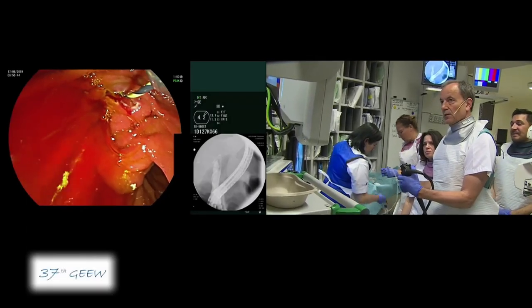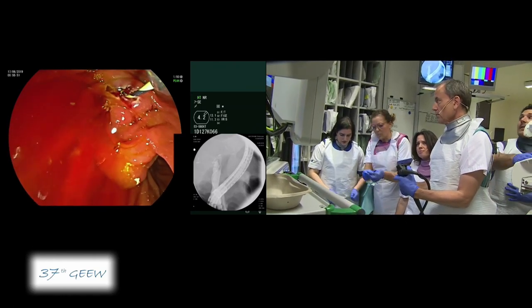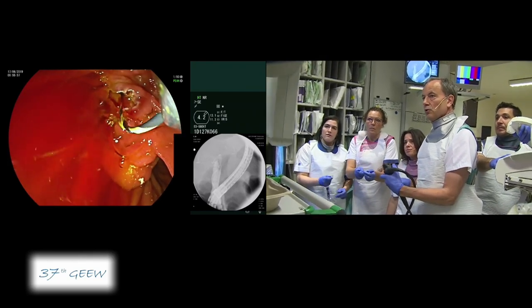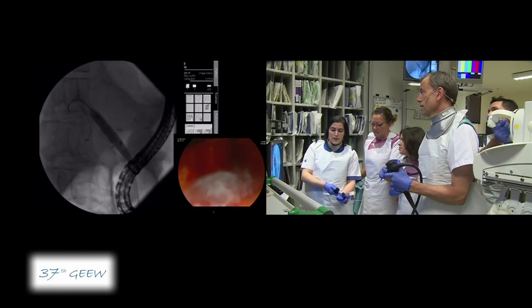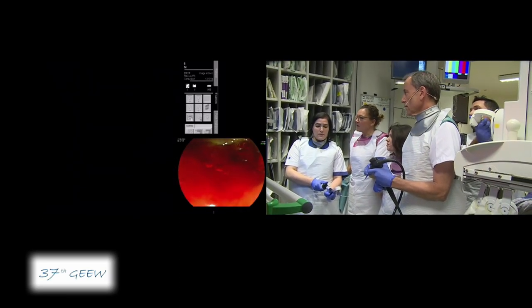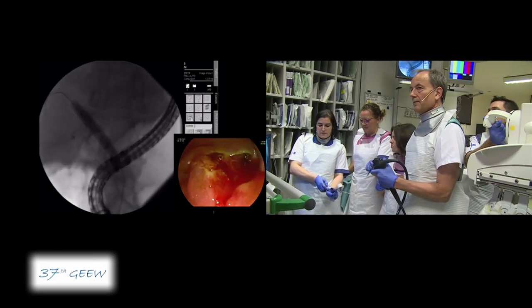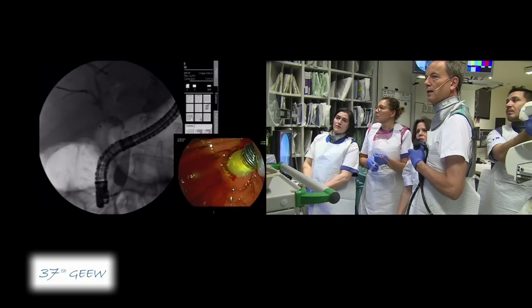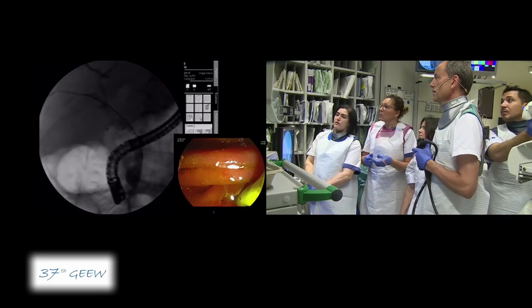The next step is balloon dilatation, and we will also sweep the ducts with a balloon because there may be some small stones or casts. We are using plastic stents. The pressure is monitored — it looks like a very soft structure, no waist. It's at 12 atm, so it's fully dilated. We deflate and leave the wire in place, then go up again to the hilum. It's stuck — inflate again.